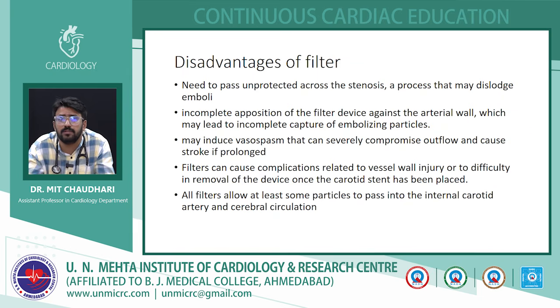All filters allow at least some small particles to go through them, and stroke can occur even after placement of the filter. But it is always recommended to use an embolic protection device prior to carotid artery intervention. Another important step: once the filter has been placed, if the patient has some embolization, then the filter will become clogged with this embolized material.